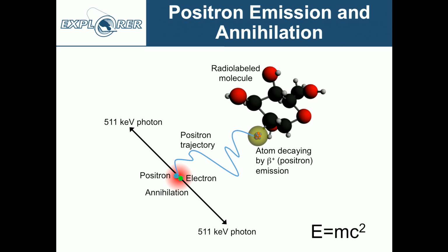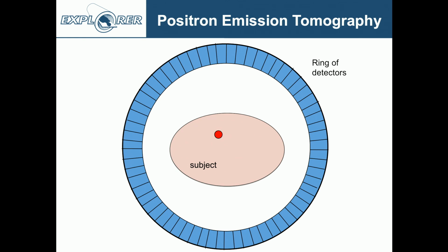So I'm going to start with the real basics because I sort of want to set up some of the challenges and opportunities that are ahead. So we'll start with the basic PET physics slide here, just to remind us that what we're trying to do is to detect, in coincidence, the two 511 keV annihilation photons that are produced following positron emission. And in the PET scanner, what we're trying to do, of course, is to detect these two annihilation photons.